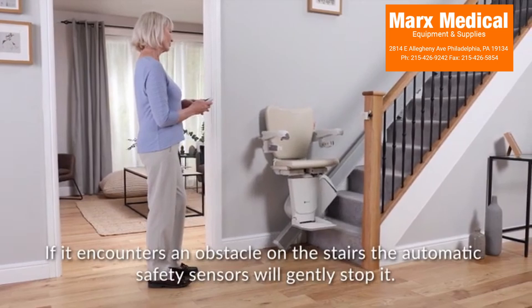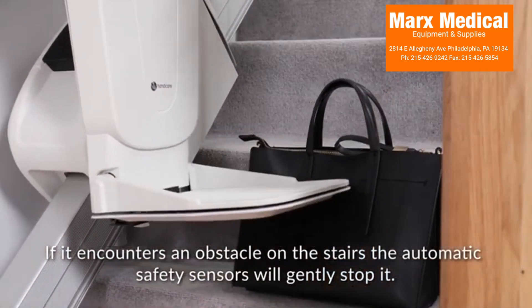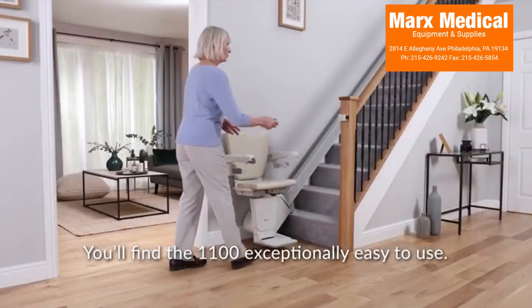If it encounters an obstacle on the stairs, the automatic safety sensors will gently stop it. You'll find the 1100 exceptionally easy to use.